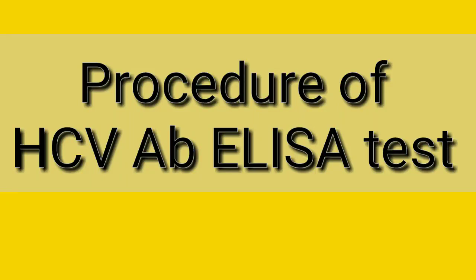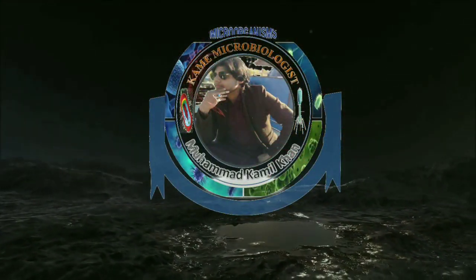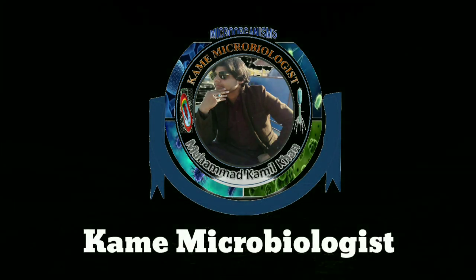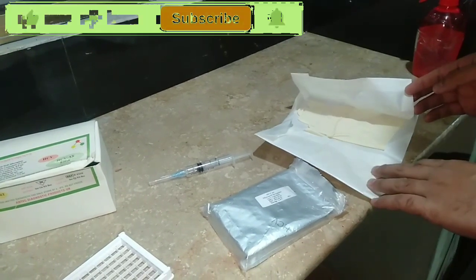Bismillahirrahmanirrahim. Today in this video we are going to see the procedure of HCV AB ELIZA test — how we perform it. First of all, let's see the purpose of the test. The main purpose is to check the presence of antibodies in human serum against the HCV antigen.